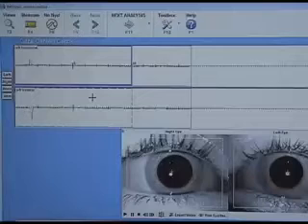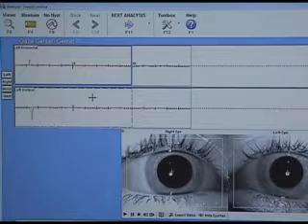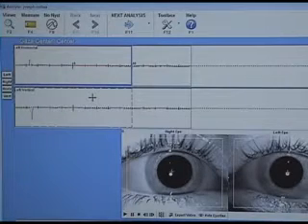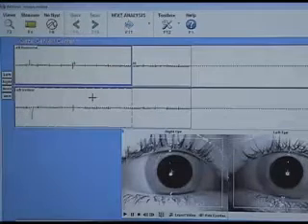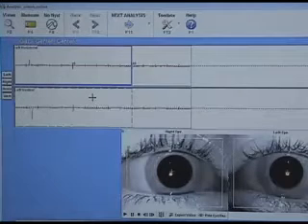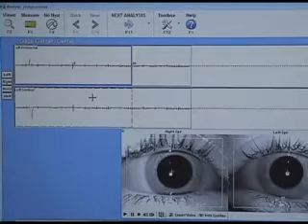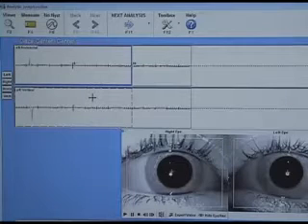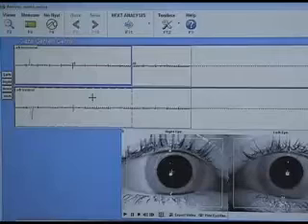Okay, now this is an example of gaze testing in our office. When we do VNG, we look at a patient's gaze, and what they'll do, as you just noticed, is stare at that dot. It's essential for the eyes to remain very stable, and when people get into head injury or if they have degenerative disorders, they can develop instability in their gaze or jerkiness in their eye movements, which can affect their balance. It can affect a lot of different things.